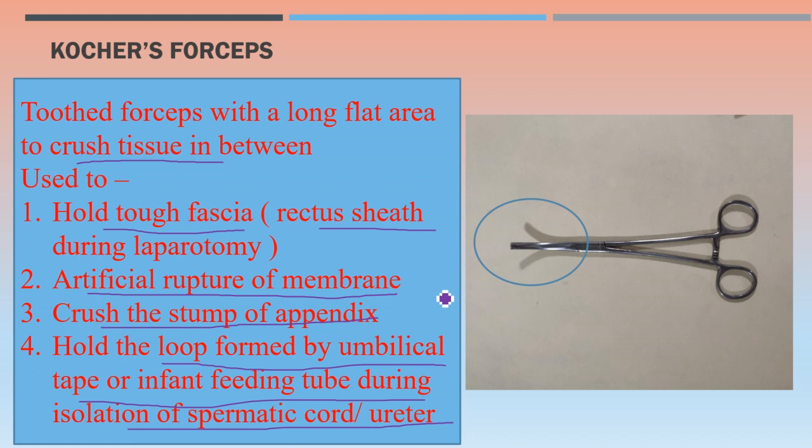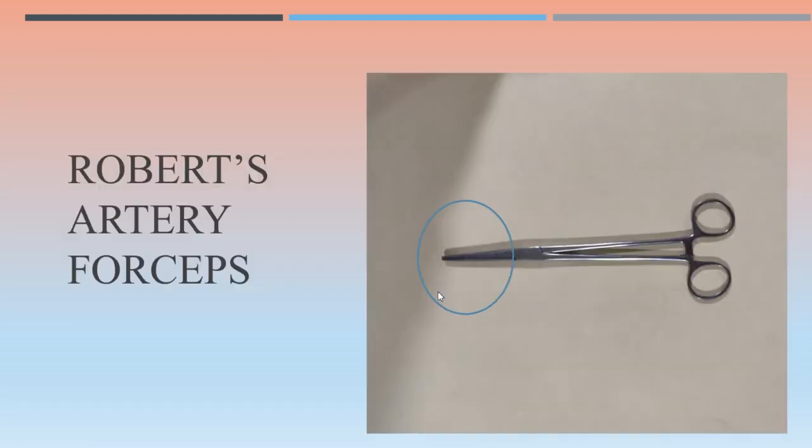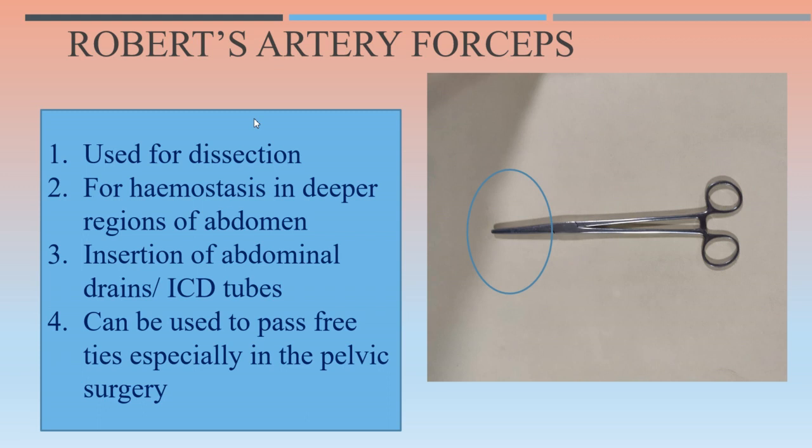The next instrument is the Roberts artery forceps — the straight one. Roberts artery forceps is used for dissection, hemostasis in the deeper regions of the abdomen, insertion of abdominal drains or intercostal drainage tubes. The longer Roberts artery forceps can be used to pass free ties, especially in pelvic surgery.